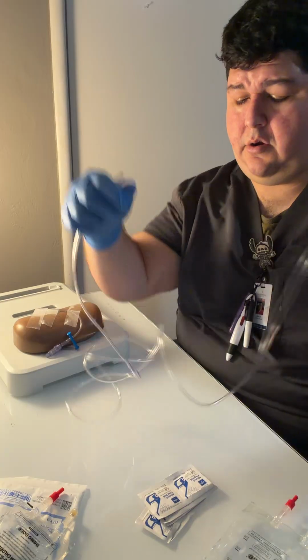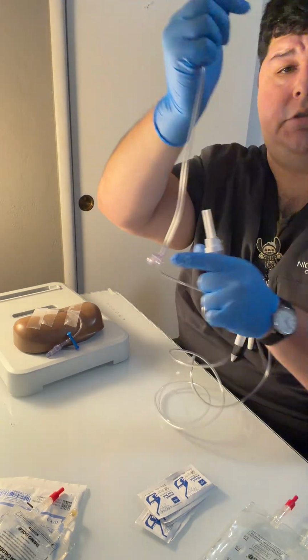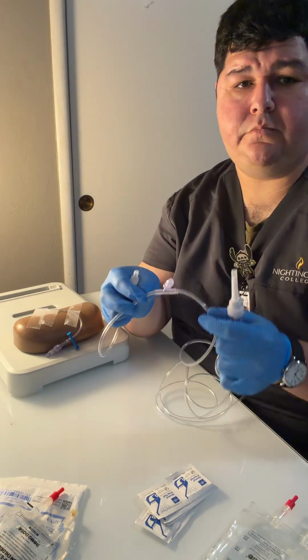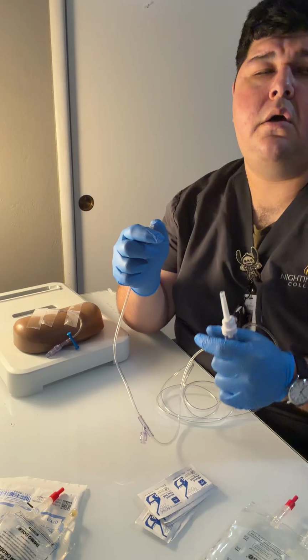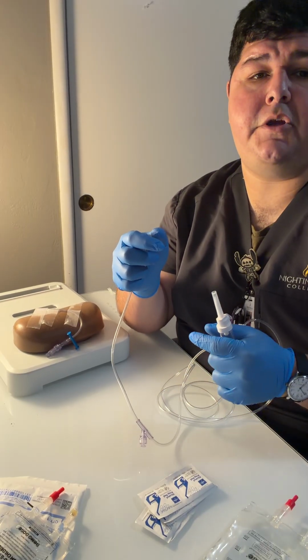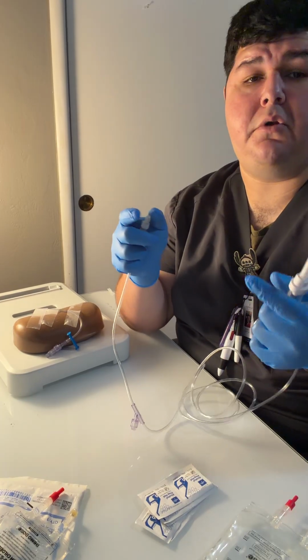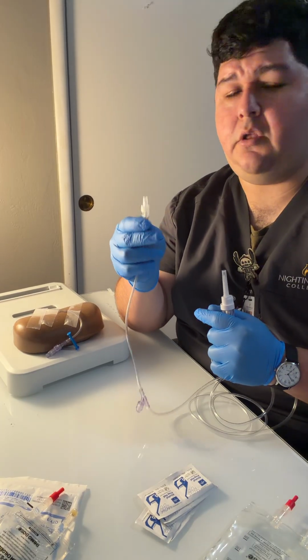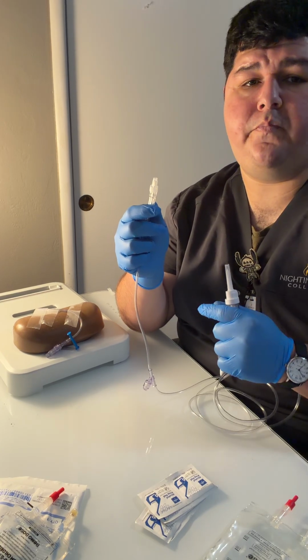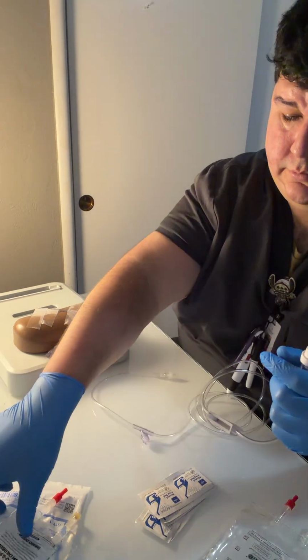And then down here, we have our Y site. This is the medication administration via piggyback IV bolus for the secondary infusion. Anytime that we use this port, we need to make sure that our medications are compatible to be able to infuse together. Finally, we have our adapter end, and this end is the one that goes into the IV site.